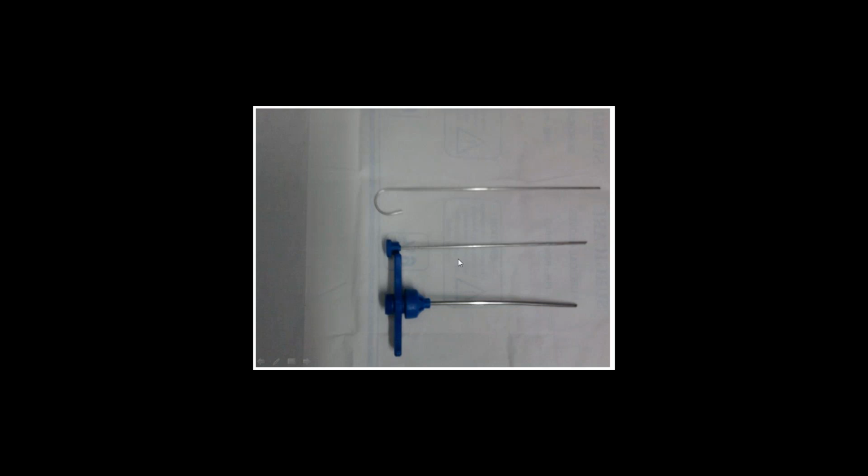The most important aspect is that once we have taken a biopsy, the needle goes in from the end which is open, and the biopsy should be pushed this way and come out from here, because if we push the biopsy in the opposite direction, through the beveled edge, it will cause crush artifacts. So it is very important that the biopsy should not be taken out from the beveled end.